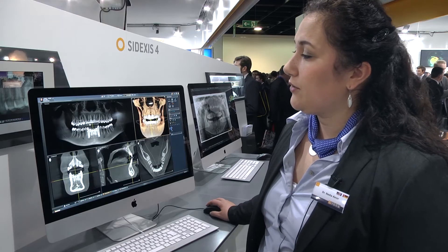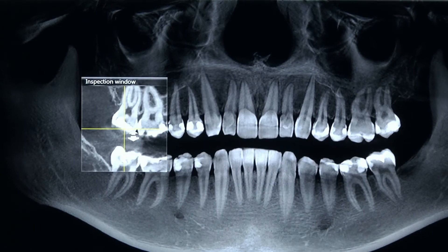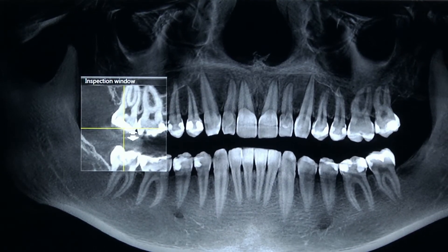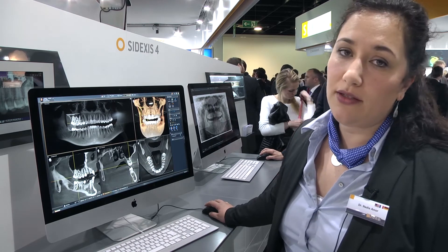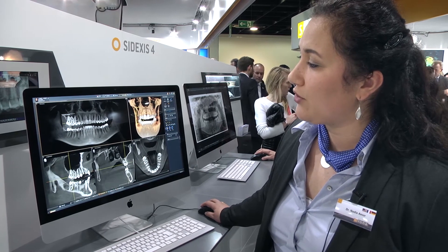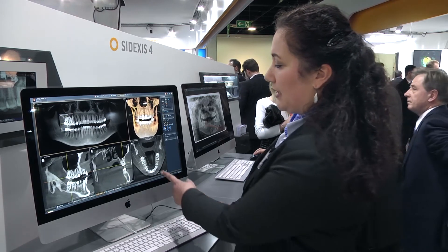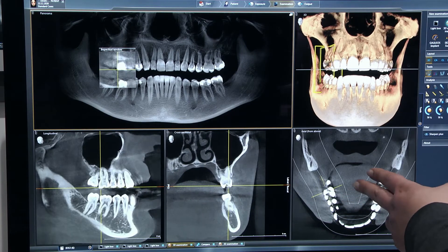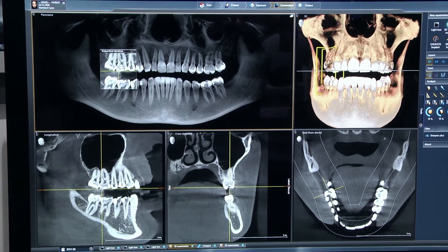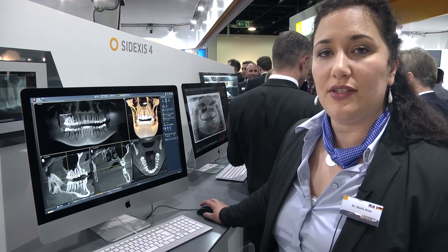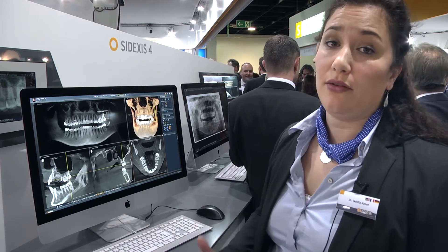The nice thing here is the inspection window. Very quickly I can move it — just do a double click. The inspection window follows and directly shows you the important slices. If you're not in the right position, just use the inspection window and follow through the slices. You can see how your focus point is very quickly adapted. You can do a similar thing in the actual view — if you just quickly want to see the other side, again just a double click, and it's that easy to work in 3D.